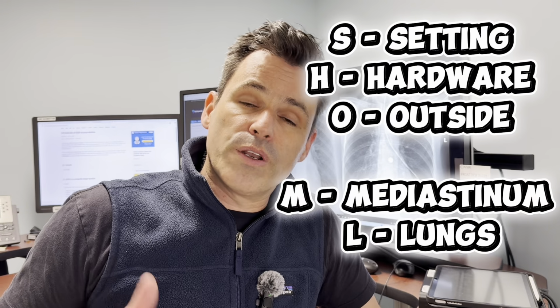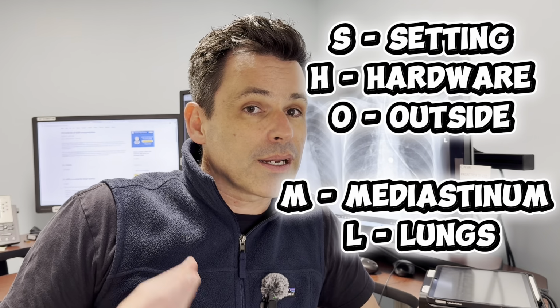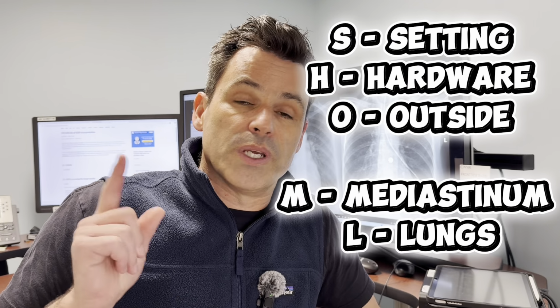There's nothing wrong with the ABCDEs. It's a great framework to be able to go through a chest x-ray mostly complete. But if you really want to read a chest x-ray like a pro, you need to go a little bit deeper. So try this acronym, show me the lungs. Run through it a few times until it becomes automatic, and I guarantee you, you'll be impressing your attendings, you'll be reading more completely, and you'll be missing less on chest x-rays.